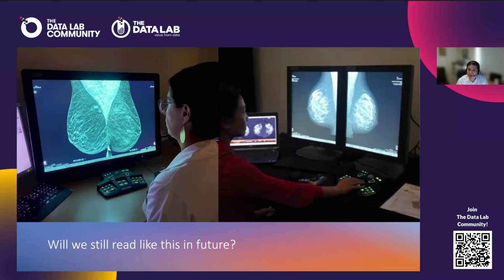On our journey in breast screening, this involves women aged between 50 and 70 in the UK, and that's 2.2 million women who have breast screening. The mammograms are usually read by 2 human beings, and then if there's a disagreement, it goes to a third human being. And that's the real question. Will we be reading mammograms in the standard way in future, left and right, with 2 humans? Or could we have AI as part of that process? Especially if you think about it, as I said, 2 million women every year in the UK.